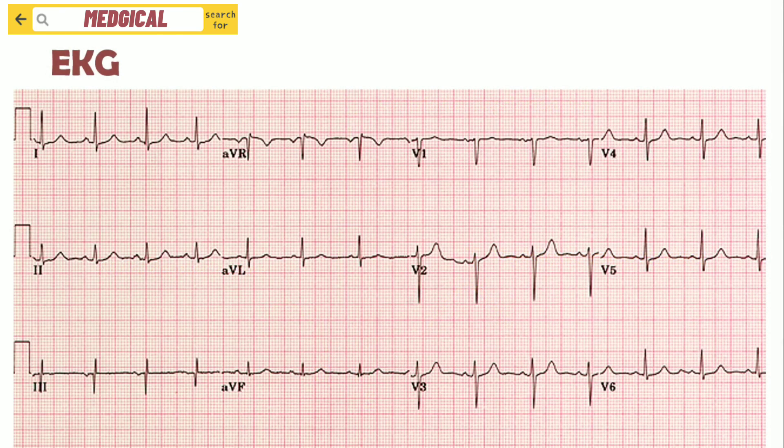In a normal EKG, we will see all 12 leads: Lead 1, 2, 3, AVR, AVL, AVF, V1, V2, V3, V4, V5, and V6.